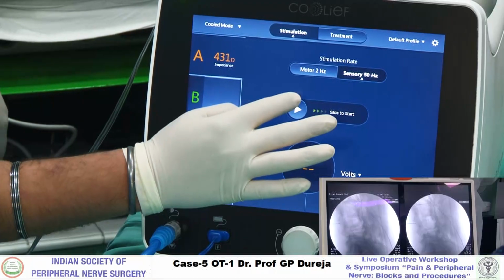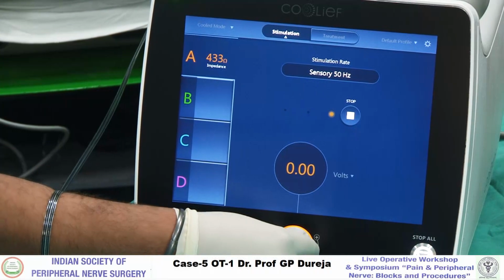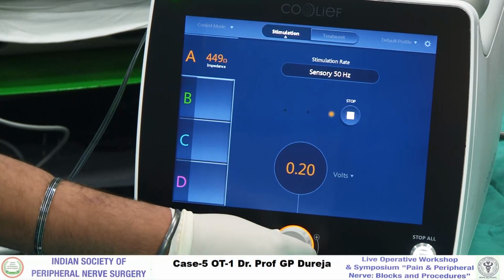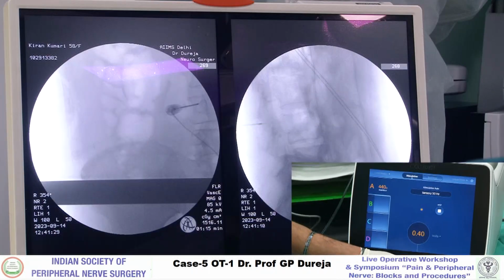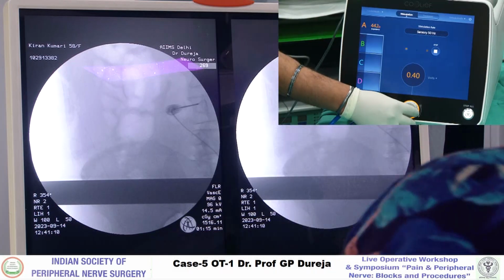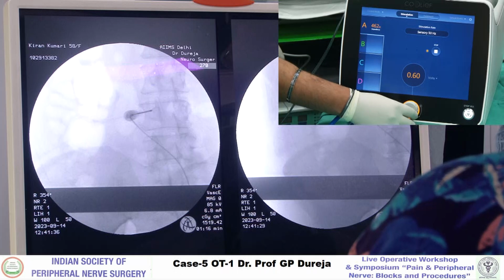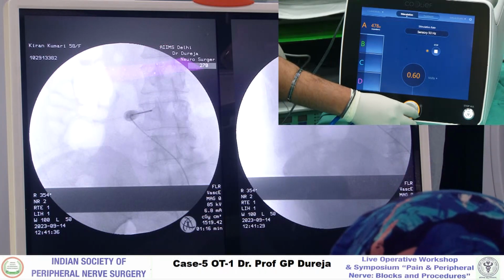अभी आपको थोड़ा करंट देंगे, आप बताइएगा. कुछ भी करंट आए तो बताए. No, nothing. No, we don't give local. Not now. So 0.4, 0.5. कुछ आ रहा है जी? कुछ आ रहा है लोकल, वहीं पे ही आ रहा है ना? हाँ जी?